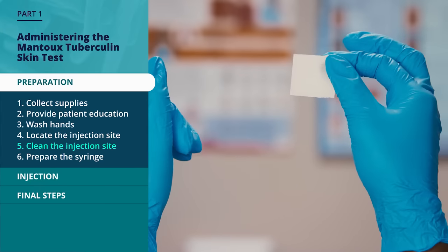To begin, collect the following supplies: a small plastic flexible ruler marked in millimeters to measure the test, a pen to mark the edges of the induration, and an alcohol pad to clean off the pen marks. You'll need the patient's record or other appropriate forms for documenting the measurement results. It is important to have easy-to-understand patient education materials available in various languages.